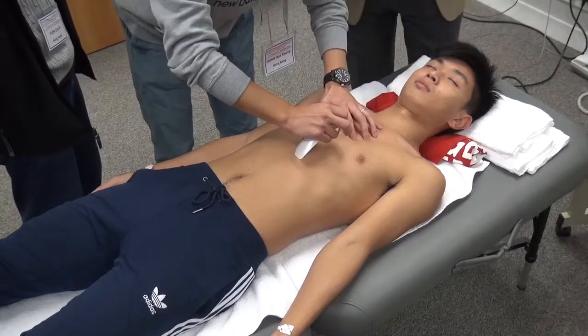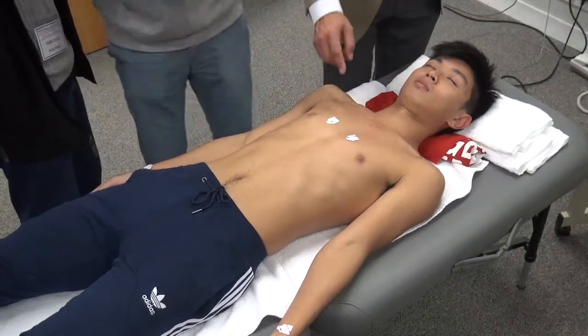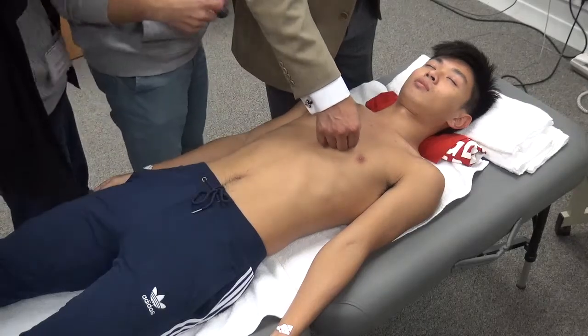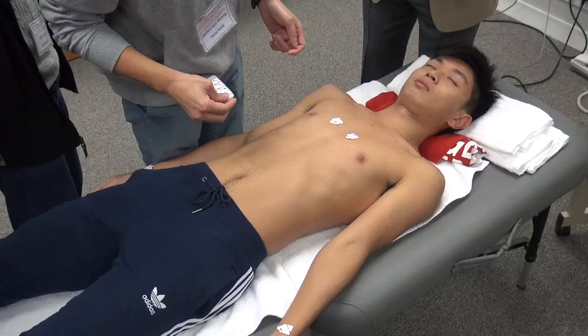Okay. So that one you can basically just follow the same one like that, yeah? And again, probably a little bit wide. I'd just say come a little bit tighter together, but there's only millimetres in that. That's the correct position. Okay, V1, V2. All right?